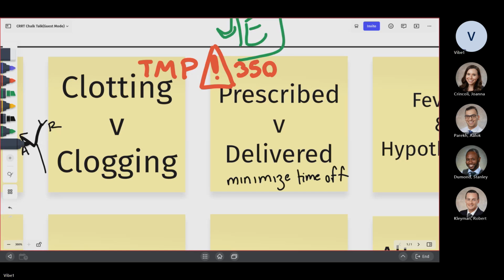That applies when the patient is already running on the CRRT. Once you have connected the patient on CRRT, there is blood in the machine, and then you're disconnecting it. You can run that machine for 3 hours. After 3 hours, if the patient is not back and you cannot hook the patient back, then you have to discard the cartridge and prime the whole machine again. So you have a 3 hour window. That's why, if a patient on CRRT is getting an MRI or a CAT scan, just try to get it done in a 3 hour window, because that way you can continue with the same cartridge. Otherwise, you'll have to throw away the cartridge.